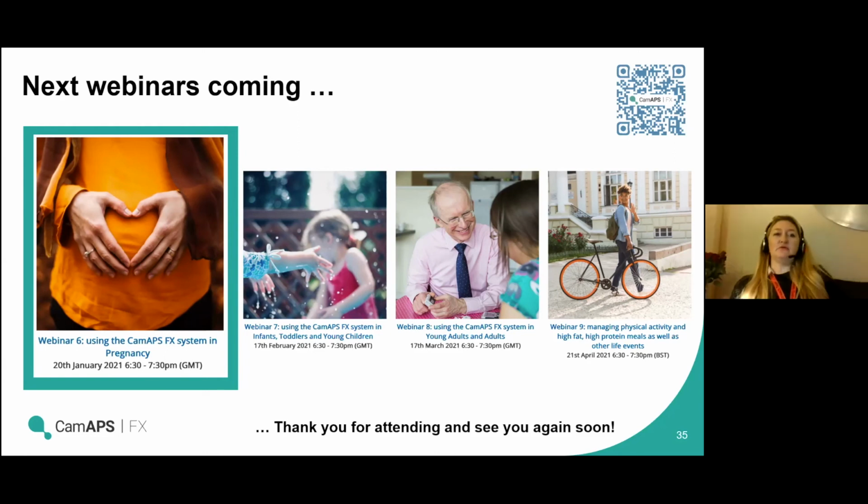As a rule, don't enter fake carbs. There's no need to, because if you want to override and give a manual bolus, then you absolutely can do that. And I think it's something that people often don't realize. If you go into the bolus menu, the little knife and fork in the middle of the home screen, on that initial screen, it will say 0, 0 at the bottom. If you press next on 0, 0, because it's not giving you anything for the glucose and you're not putting any carbs in, it takes you to the next screen where you can tap on the 0 that will appear, and it gives you that barrel roll where you can put in your 0.2 if that's what you want to do.